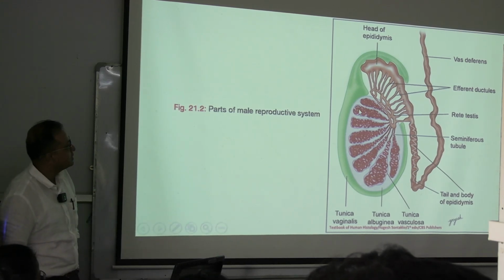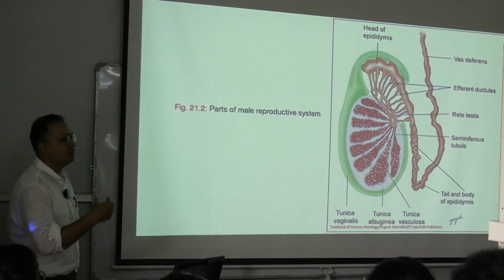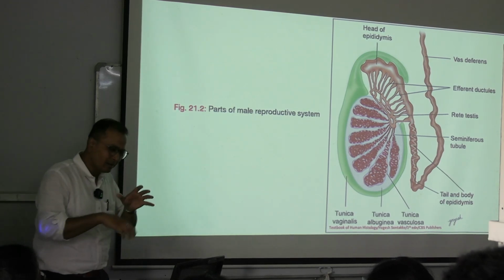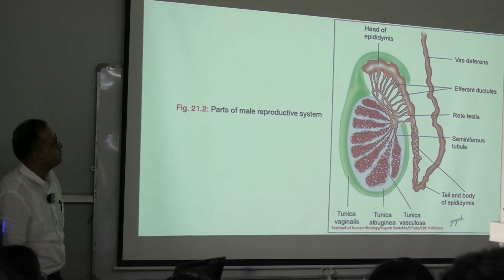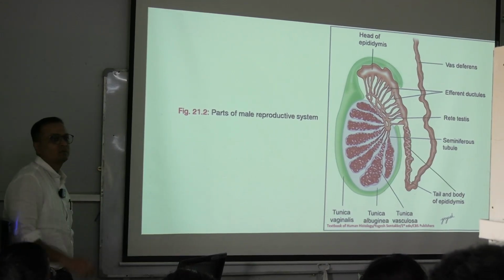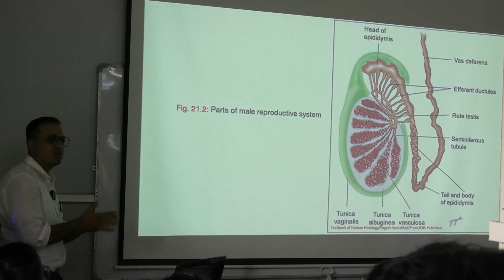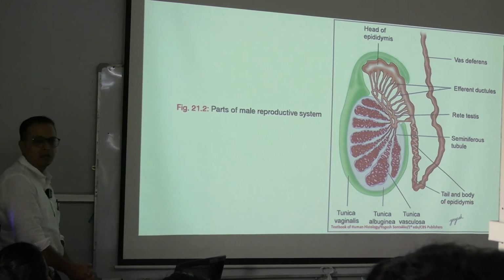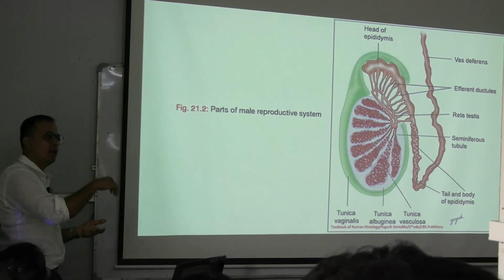Now, whenever you see these seminiferous tubules, if you cut them through sections, they may look circular, oval, or like elongated oval-shaped structures. Within these seminiferous tubules, there are two basic types of cells we are going to identify. One is supporting cells, which are resident cells. The other we call migratory cells. Who are migratory cells? They are not inhabitants of that region; they come from elsewhere.